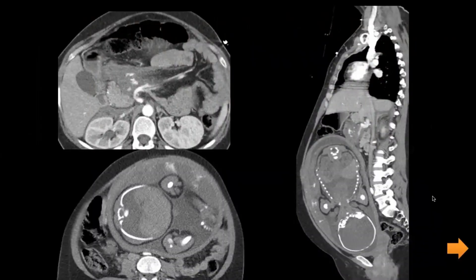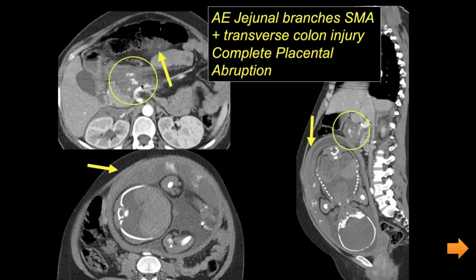Other injuries from branches of the abdominal aorta may also be diagnosed on CT examination. This is an unfortunate case of a pregnant woman who presented with active bleed within the mesenteric hematoma, a pericolonic injury with transverse colon injury, and complete placental abruption.